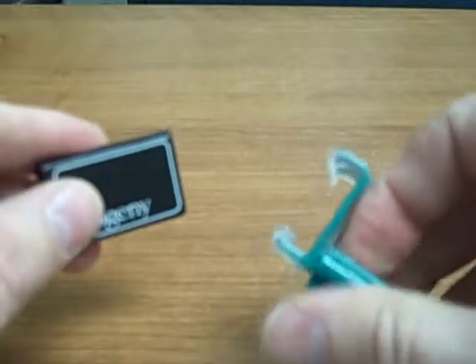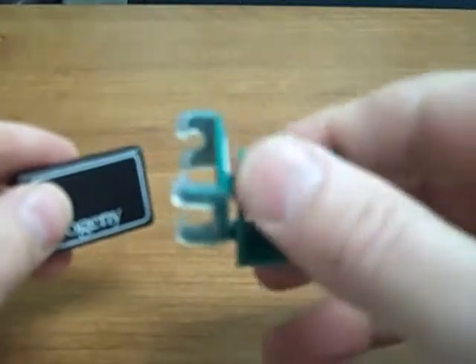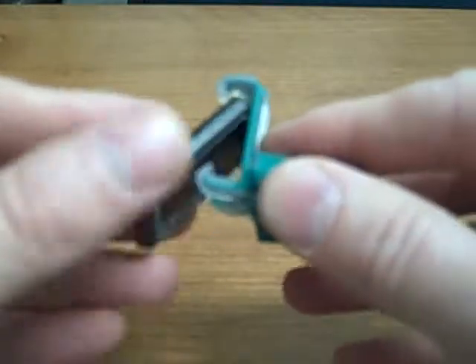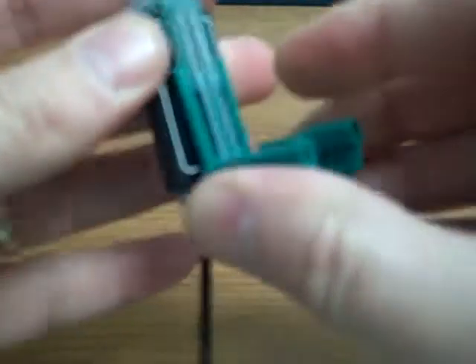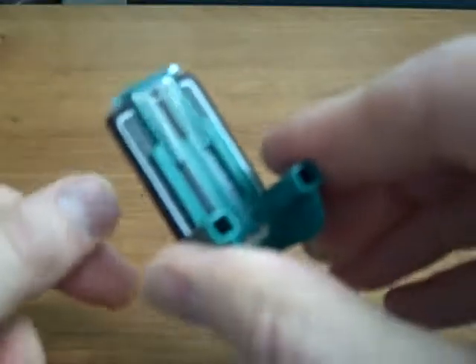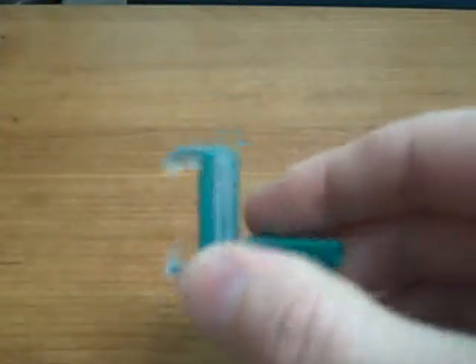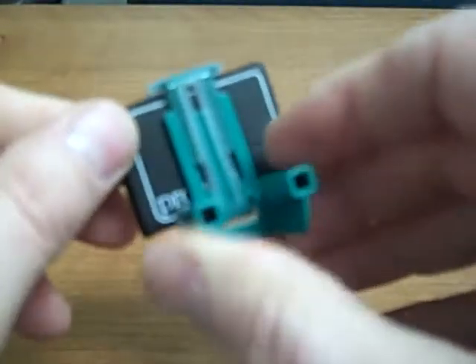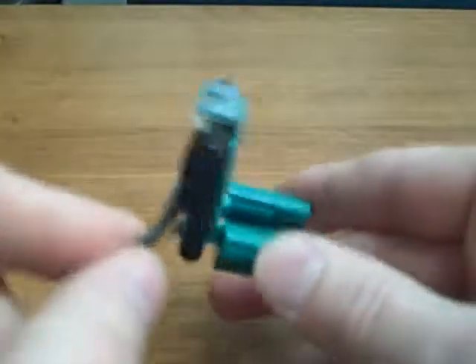The XCP-DS Fit system also is available with a universal endodontic bite block. The neat thing about this bite block is with a size 1 sensor, the bite block will hold it in a vertical orientation. Or with your size 2 sensor, it will hold it in the horizontal orientation. That's the green endodontic bite block.